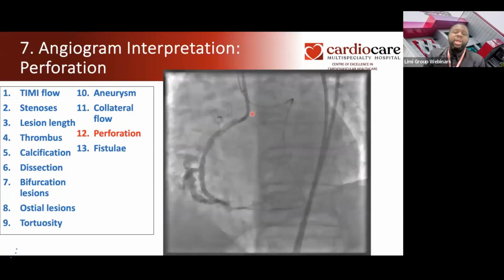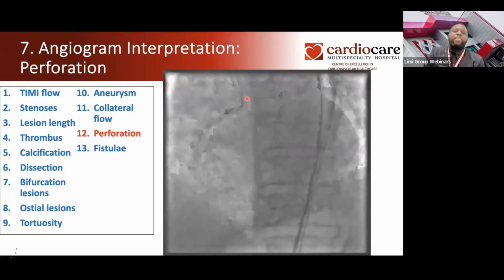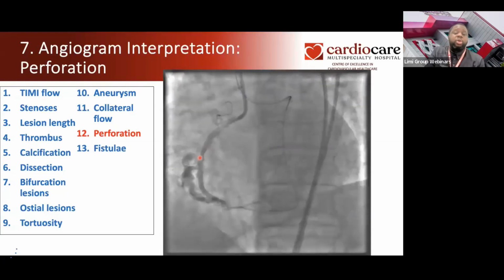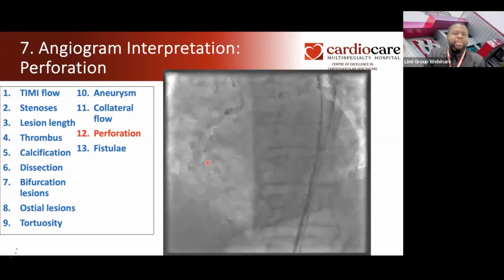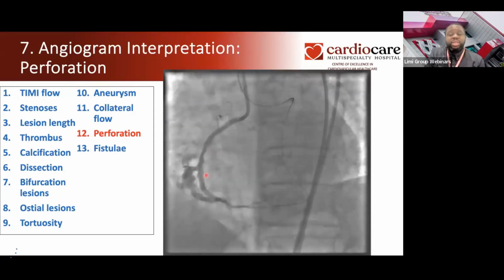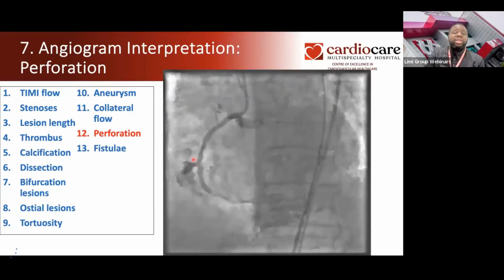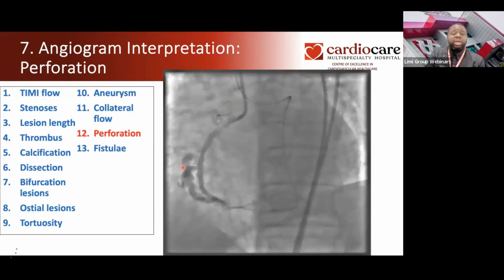So they went through the left, went through the back, opened through the back, and then came back to the front where they have opened, because they could not pass the total occlusion to the front. They had to break through calcium, use balloons and bust it open and crack it open. And then when they finally put a stent and got flow, eventually they had this perforation. And this is showing contrast spilling, which is blood spilling.